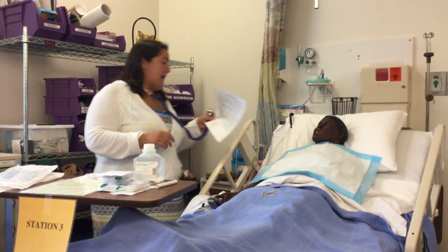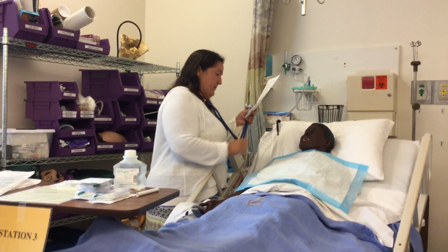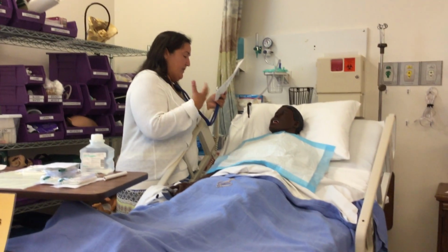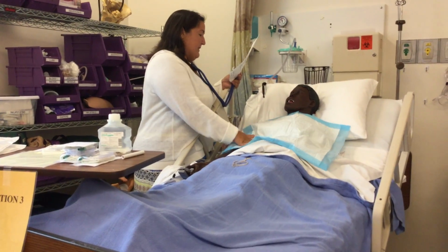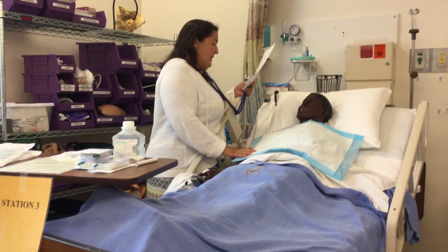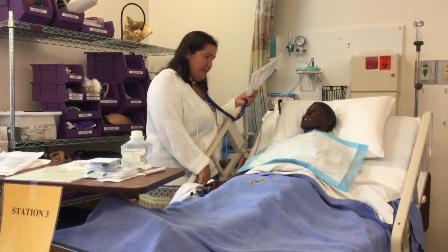You want to make sure you listen to your patient. You're going to hear them coarse, so that is an indication that they need to be suctioned. You're going to hear the upper airways lots of times are blocked up. So you've assessed them. You want to have them sitting up, in like a semi-Fowler's, so you want them pretty high.